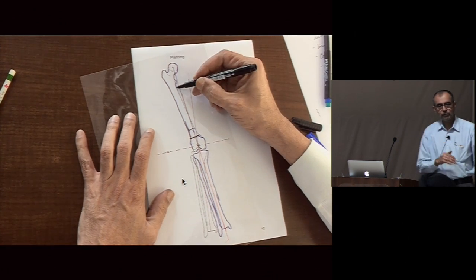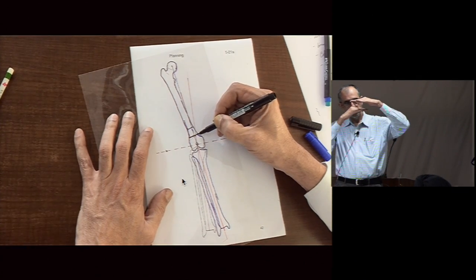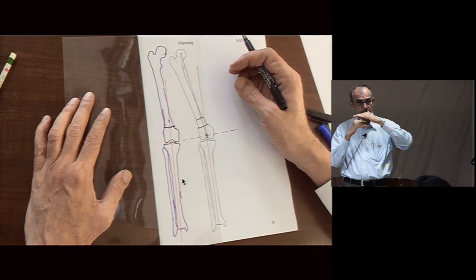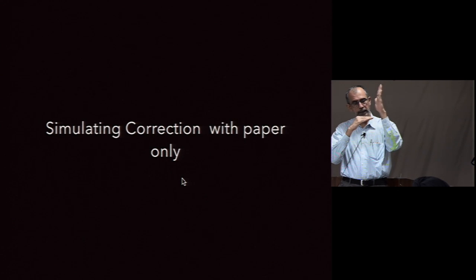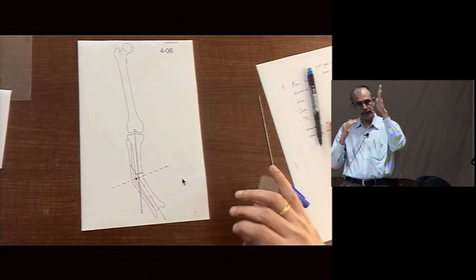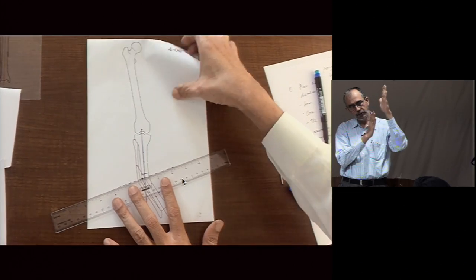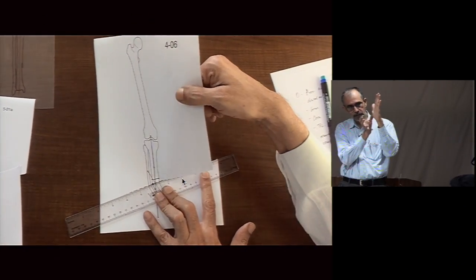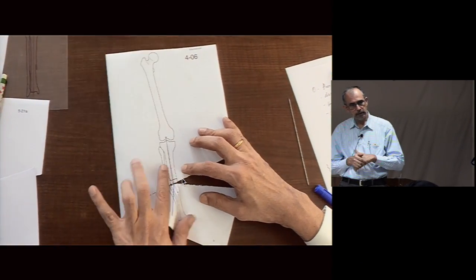When you do a DCS, what do you do? You are supposed to put your device parallel to the joint, because the device is made in such a way that it should be parallel to the joint. Okay. After you put this parallel to the joint, then you fix your plate to the bone. Now if you do not put your device parallel to the joint, then the device, when you push it to the plate, will push the distal fragment inside. So your distal fragment then becomes prominent.